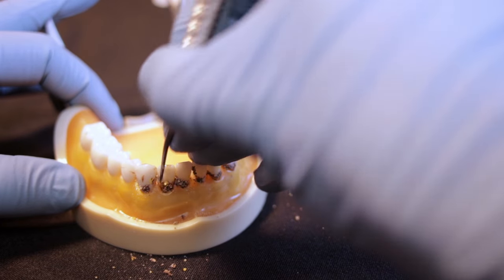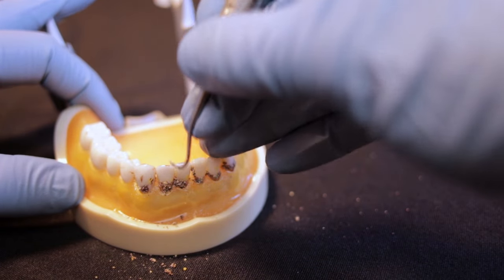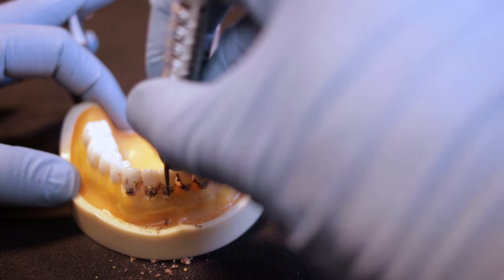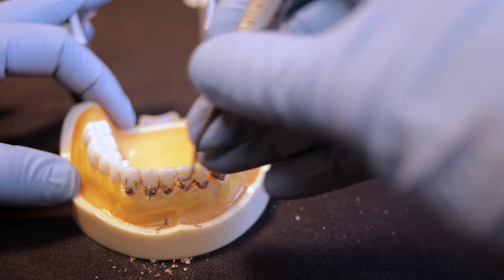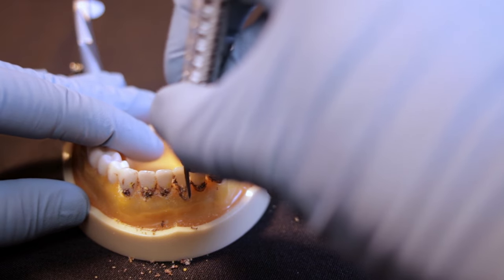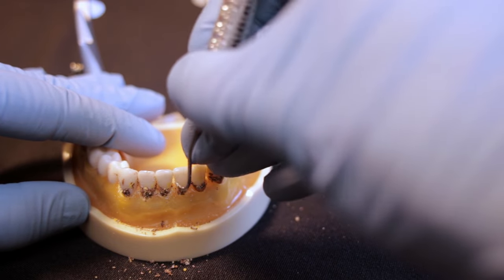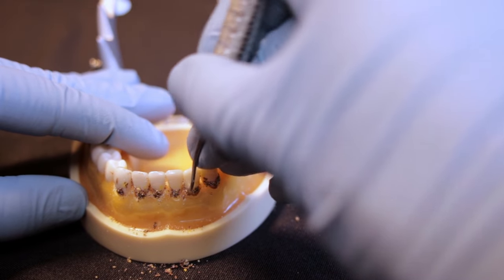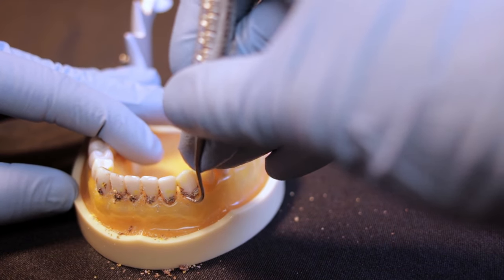Just a reminder: do not forget your angles. When using a sickle scaler, lean into the surface you're scaling on with just a little bit of angle — not too much. A common mistake is students using a posterior sickle such as a Nevi 4 with the instrument leaned over way too much, making the angle too big and the instrument too thick. That means they can't get right underneath the contact of these anterior teeth — we need something very thin to get under the contact where calculus is commonly seen.